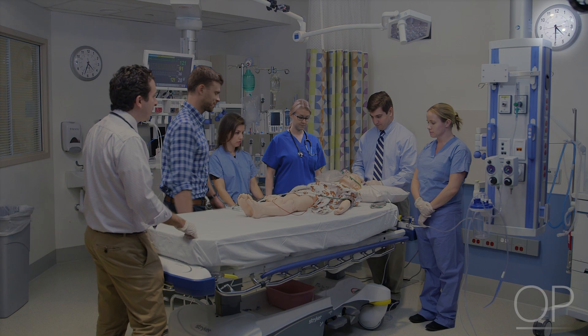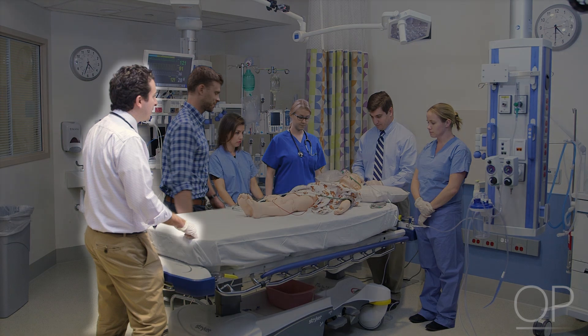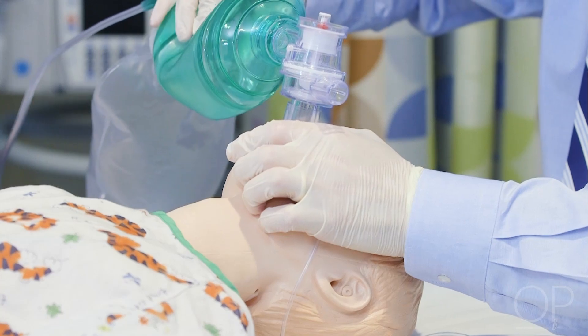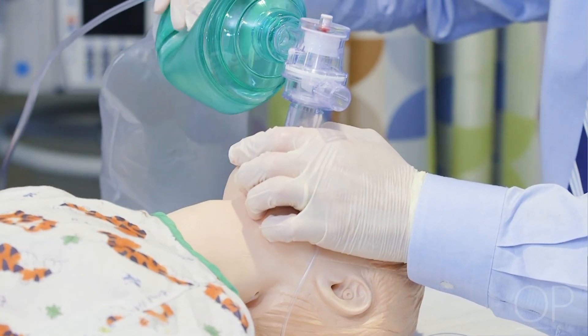Teams must be mindful of the duration of intubation attempts. The team leader should clearly communicate with the intubator to stop a given attempt and provide rescue ventilation, ideally before a patient shows signs of desaturation or clinical deterioration.